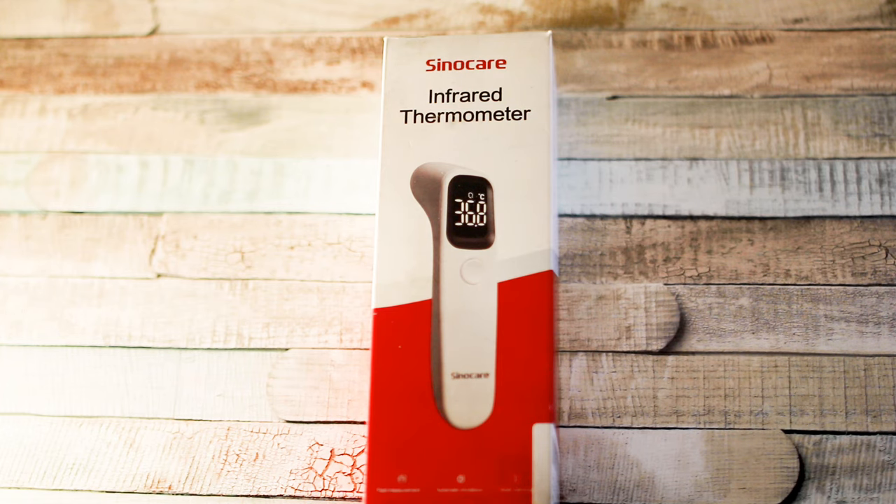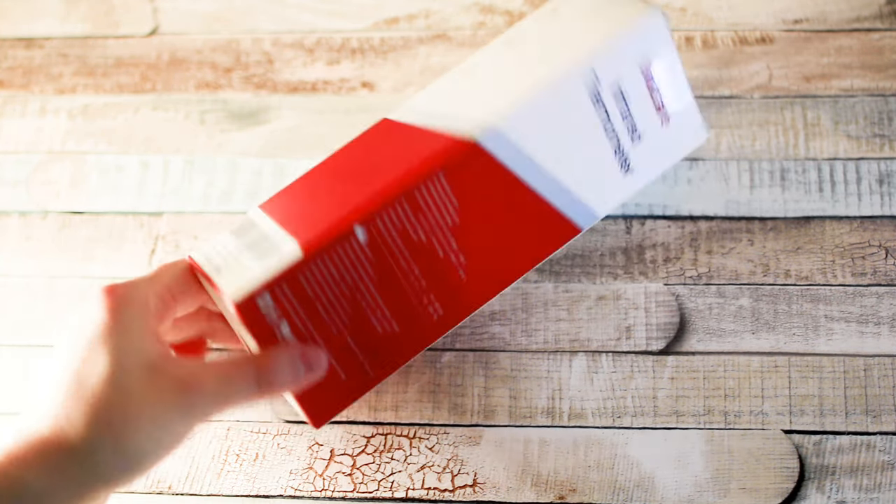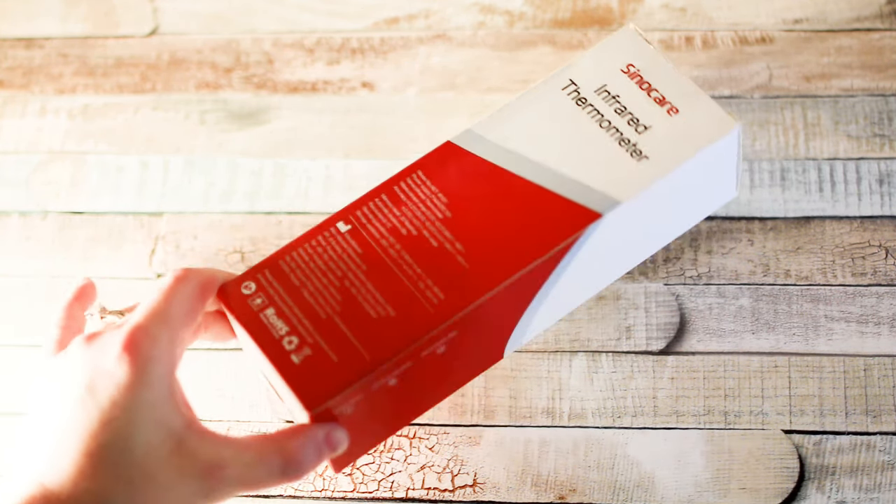Hey everyone, today I have a CenoCare infrared thermometer I'm going to check out for the first time. Still 100% boxed as it was, so I'm going to take it out, take a look, and see if we can give it a try.